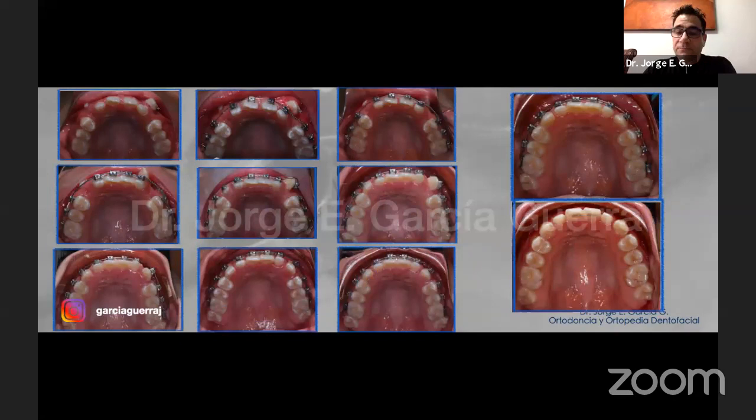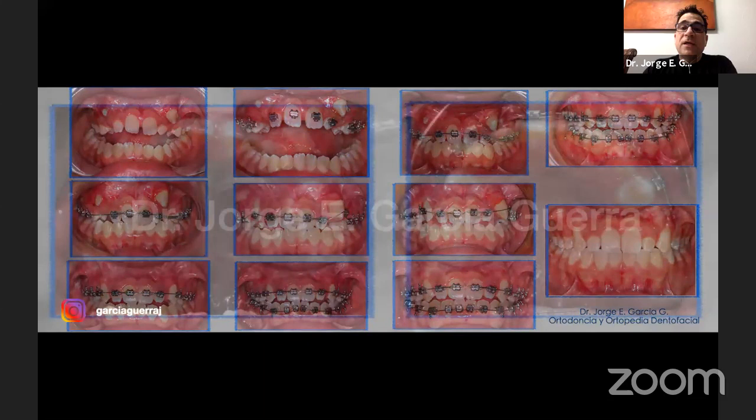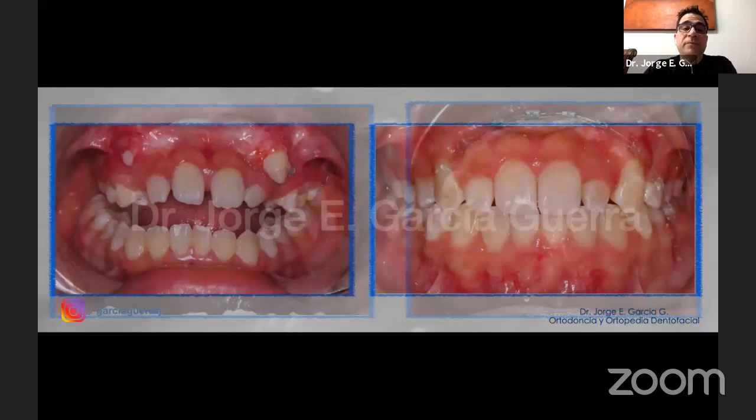Now we have here the progression of the treatment, how we finished the case on the upper, and you can see the frontal view, how we moved the canine, how we put it in the position, and at the end. You can see the arch form and the finish of the treatment.